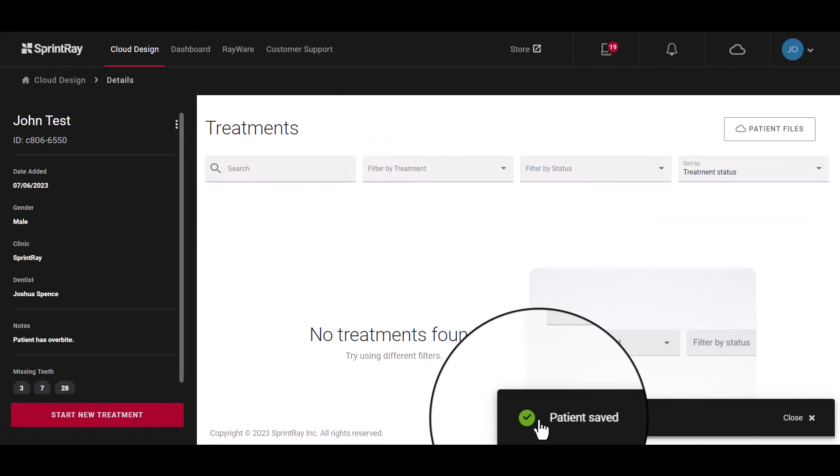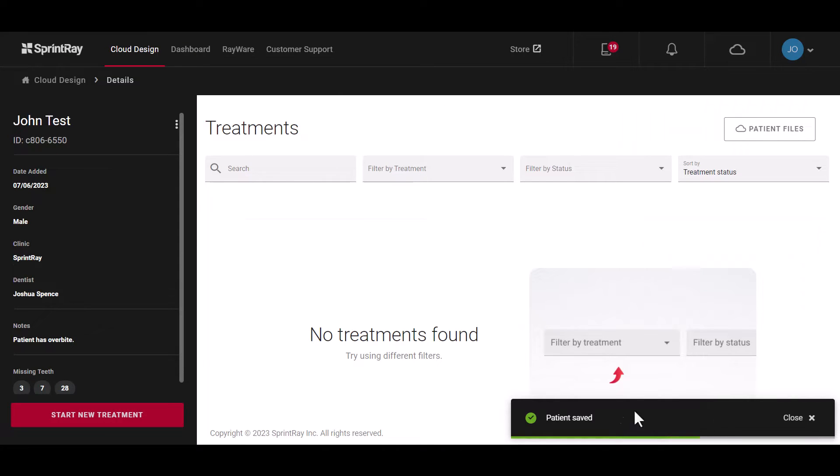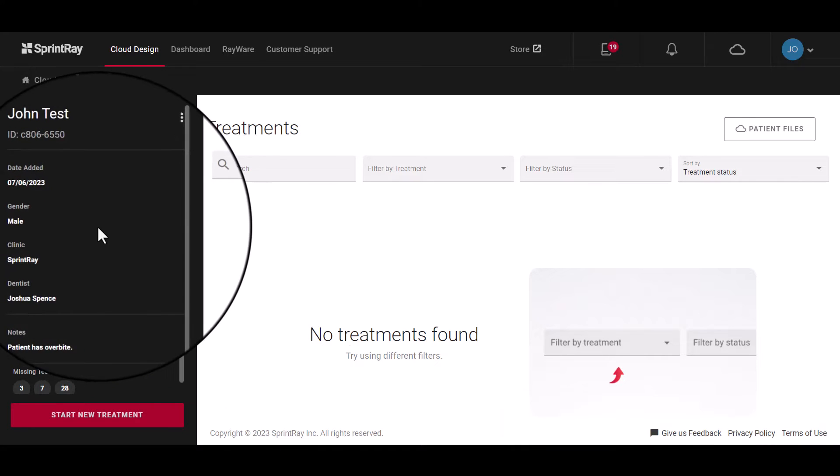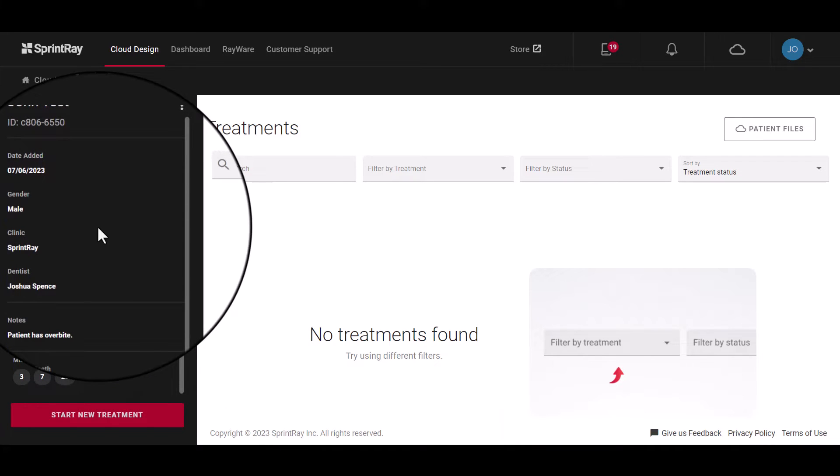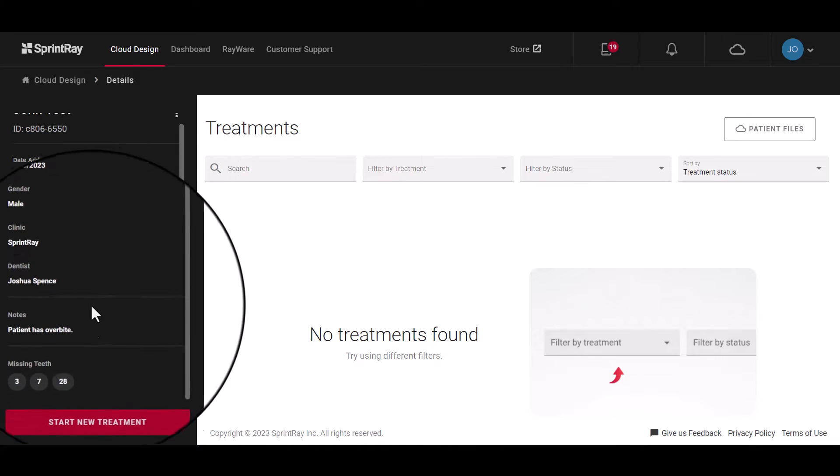When a new patient is created, cloud design will indicate that the patient has been saved and you will be able to preview the patient's information at any time on the left-hand side.